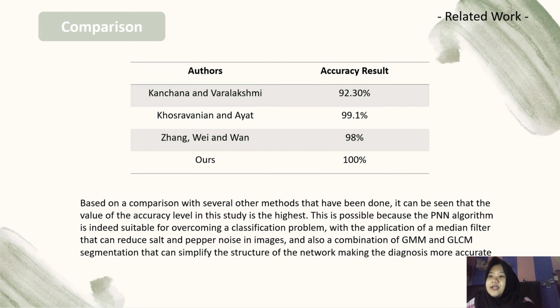And Yaba researched the detection of tumors in the true screening test of mammography. The discrete wavelet transform method was used in this study with a dataset of 50 mammogram images and producing an accuracy value of 80%.